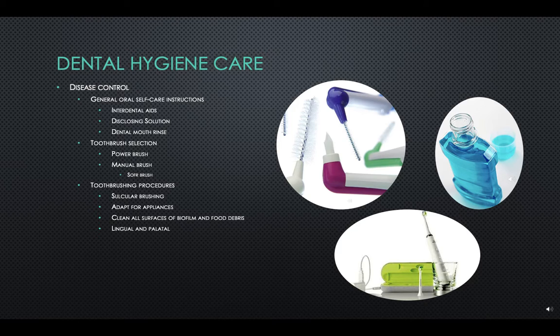Place the brush with filament ends directed toward the occlusal surface to clean under the wire and bracket for the mandibular arch. Place in Stillman position for the opposite side. Clean all surfaces of biofilm and food debris. To ensure cleanliness, one needs to brush the appliances in any way that the filaments can be manipulated. Insert the brush from below, over, and above the arch wire. Rotate and vibrate to remove biofilm and debris.